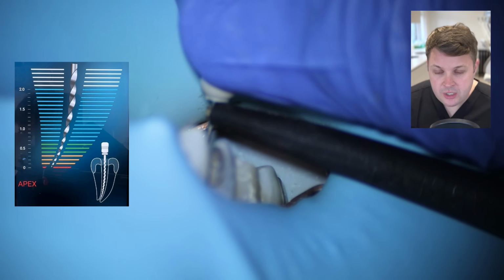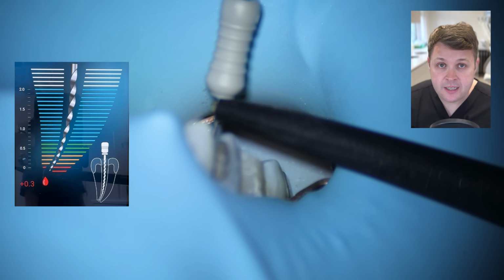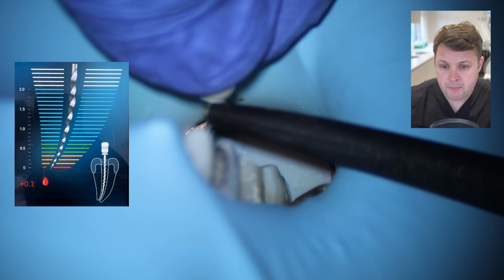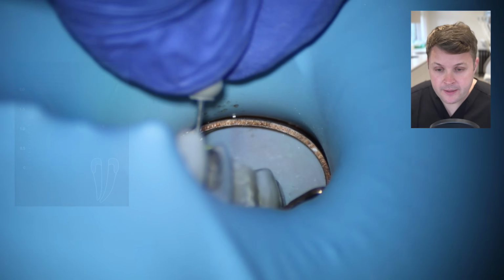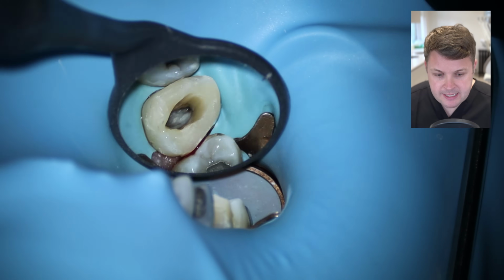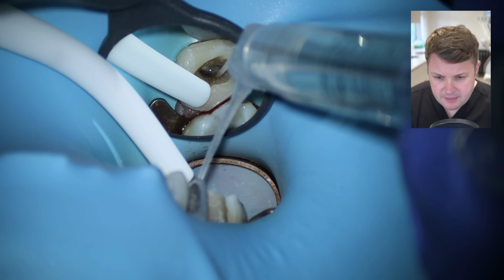I'm not getting much resistance at all. We get our 0 reading. We then push the hand file through the 0 reading, so we go past 0, and then once we pass 0, we sort of back up the hand file, and once that reaches the 0 reading while we back it up, that's our apex locator reading. We move the stopper, of course, and we measure it, and we can see that the DB canal is 19 millimeters.